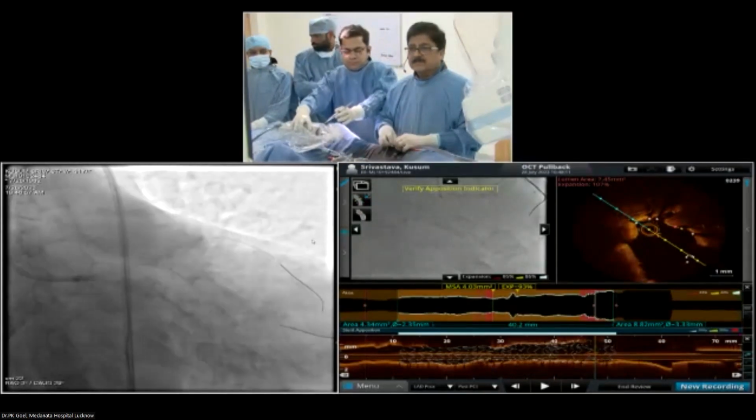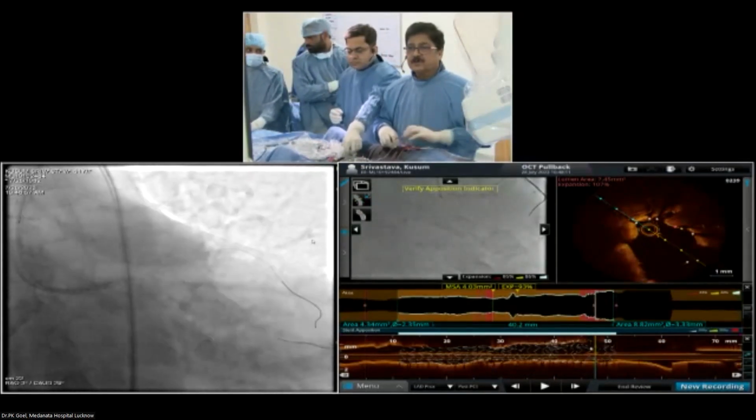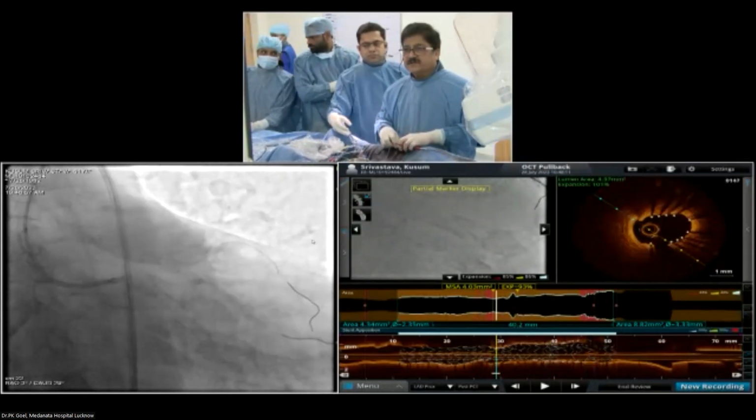Dr. Goel, we are back with you. Yeah. Okay, so I am doing the last run from the circumflex.